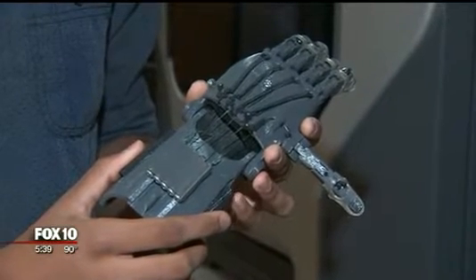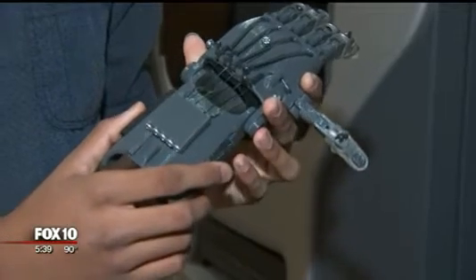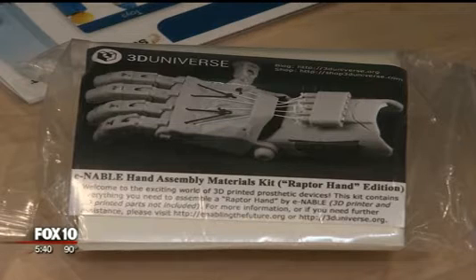Raul J, a student at Basis Chandler, started the Hand Challenge initiative here in Arizona this past summer. His goal: to create, build, and assemble 30 prosthetic 3D hands to be donated to the Hand Challenge, an organization that helps children in need.